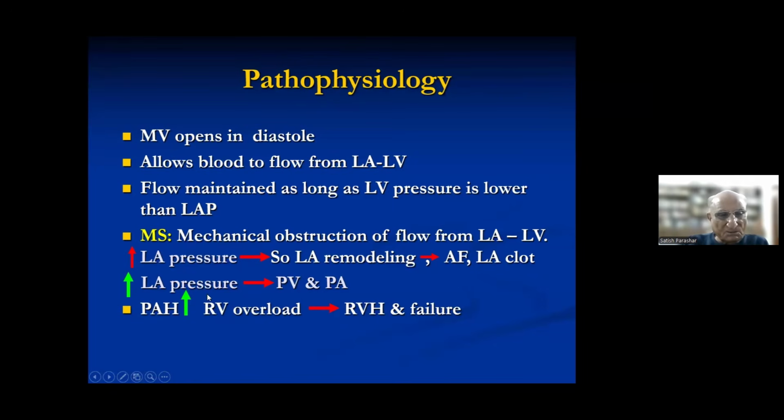So we normally don't allow the patient to go into this stage. So in this pathophysiology, when you do an echo, you see the LA, LV in detail, you see the pulmonary artery pressure, look for RVH and RV enlargement, and these are the signs. So again, I repeat, anytime, any problem, please go on interrupting. So this is the basic pathophysiology.